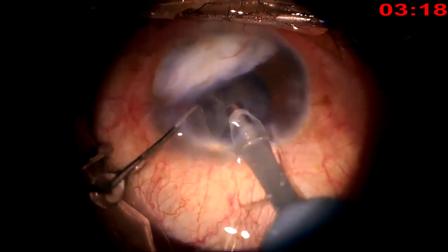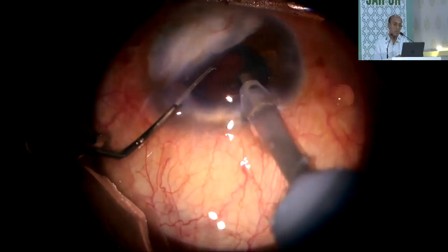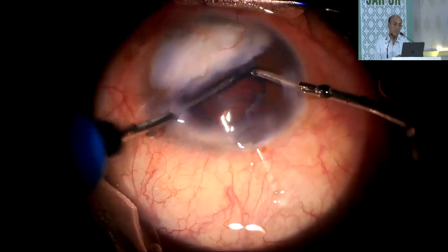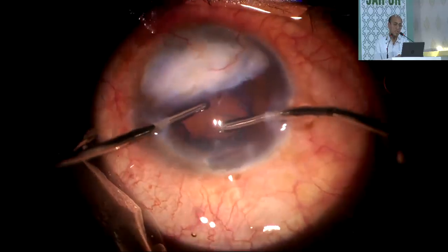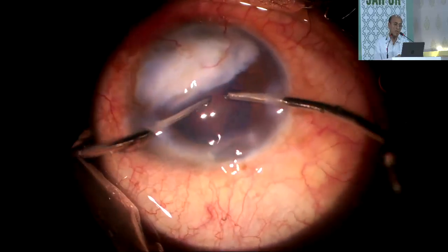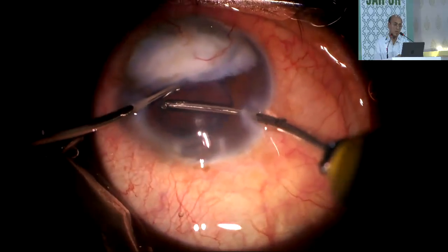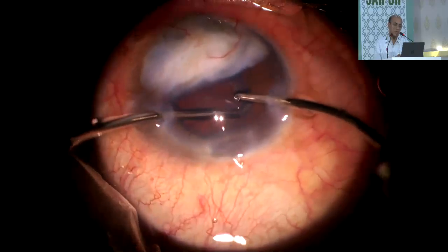You can see this phaco was done, and there was no problem except visibility in the nasal part, which by tilting the eyeball we could see, and bring the pieces to the temporal side where the cornea was clear. All these pieces were nicely taken and aspirated. You can see a nice glow was also there. After that, routine irrigation aspiration was done, again taking care on the nasal side where there is a corneal scar. In the rest of the area, it was routine irrigation aspiration of the cortical matter.